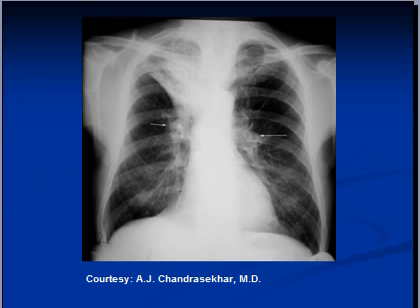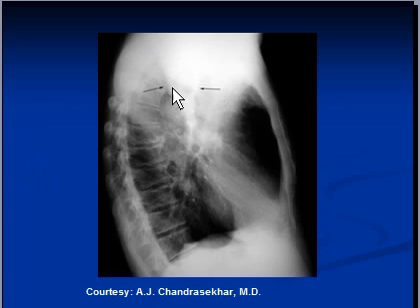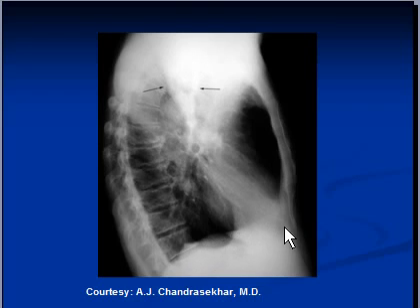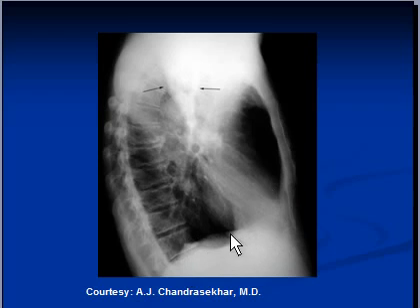On the lateral view, you can see the V shape. This is the horizontal fissure and this is the oblique fissure, which should normally be positioned further back. The right hemidiaphragm is a bit higher than the left hemidiaphragm. This is the left hemidiaphragm because the cardiac shadow is continuous with it.